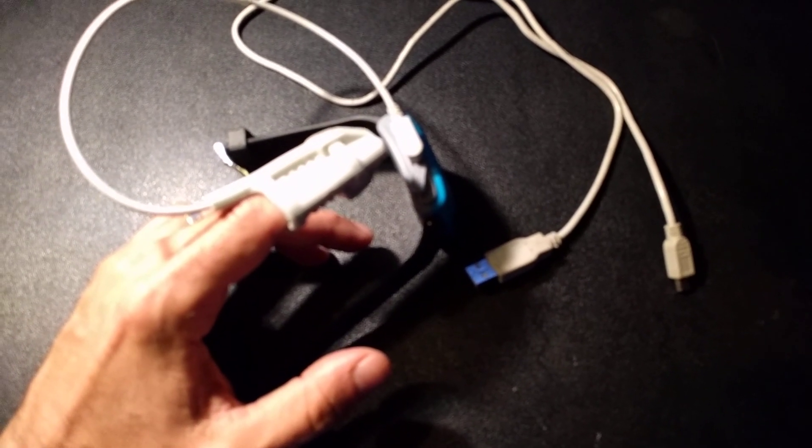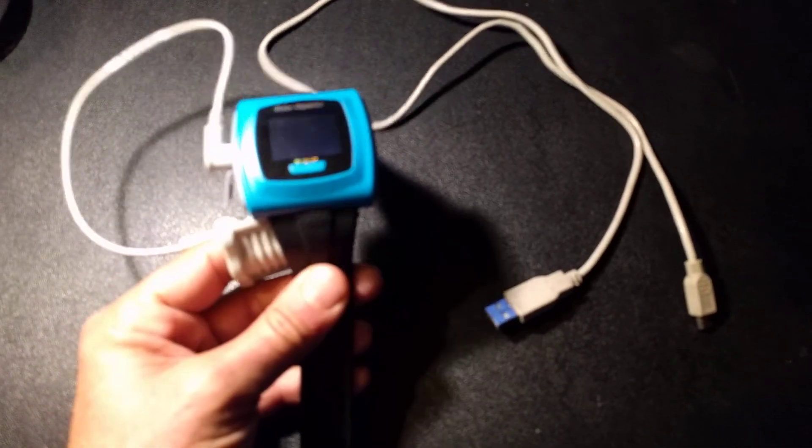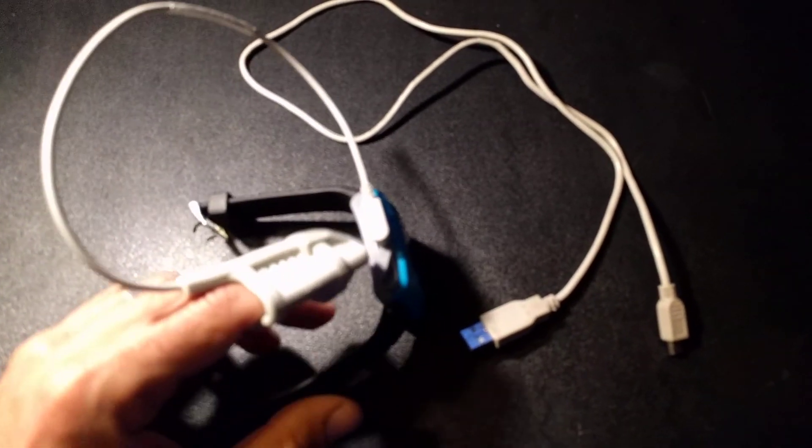Hi, I'm going to show you how to do an overnight pulse oximetry study. You're going to be shipped three items: an oximeter, a probe, and a USB cable.